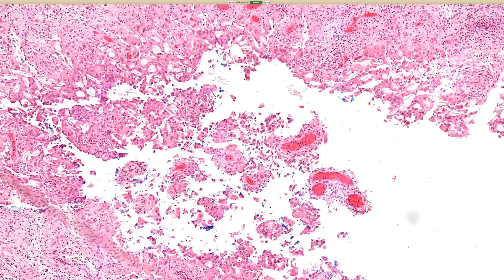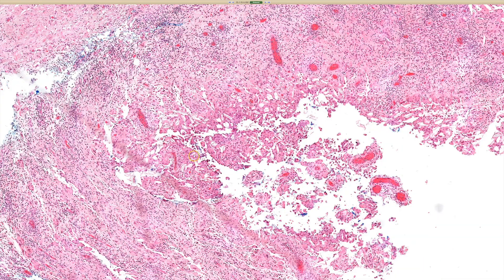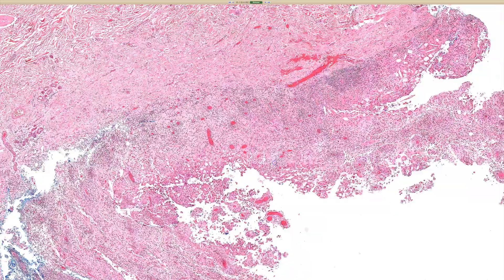I had a case like that, actually, where it looked very much like a ruptured cyst but there was no keratin. We said probably it's just a ruptured cyst, but then it recurred right by the excision site. On recurrence, it had more neutrophils, more granuloma, and the distribution was kind of weird. There were AFB organisms — acid-fast bacilli — and it was actually mycobacterial infection. But in this case, this is just a ruptured cyst, and this pattern is called a keratin granuloma. Good job.